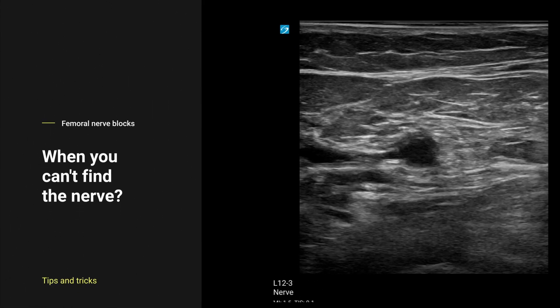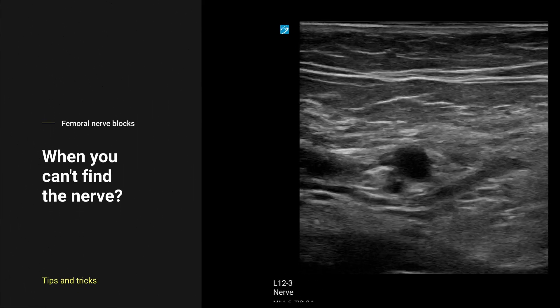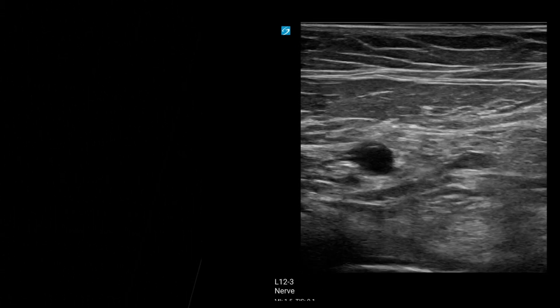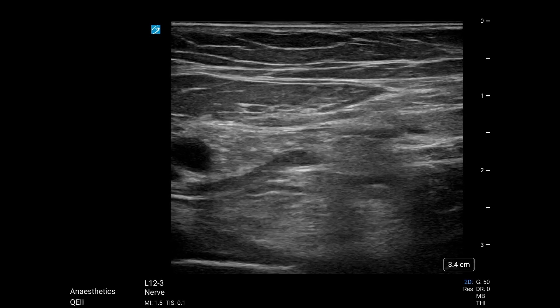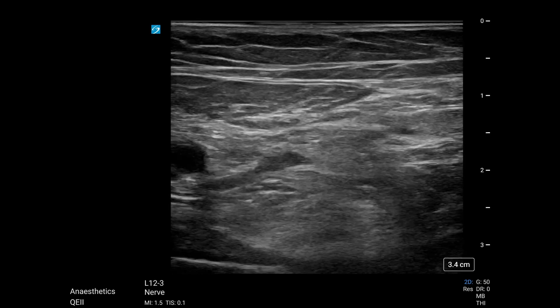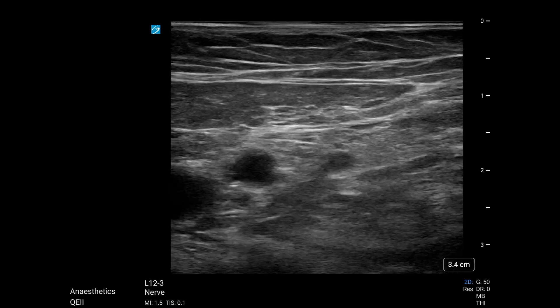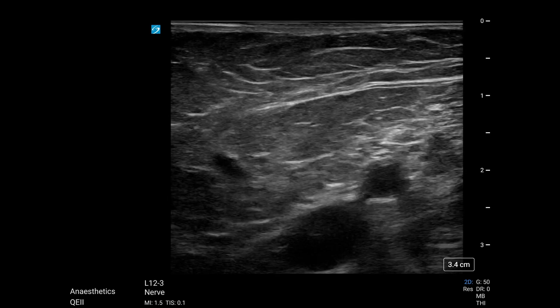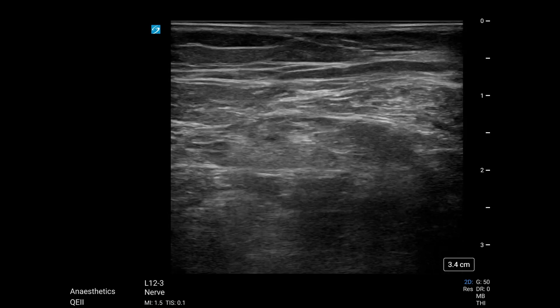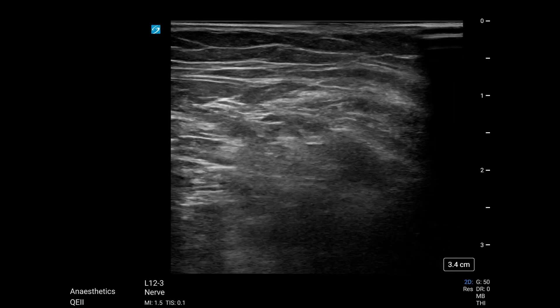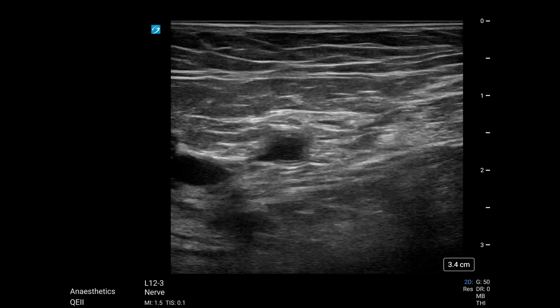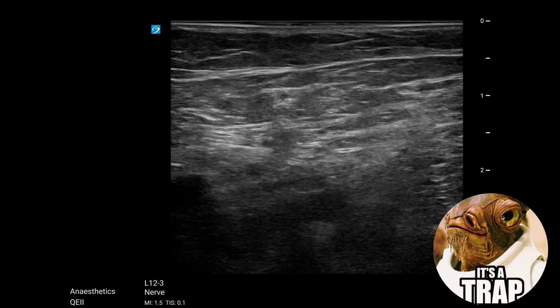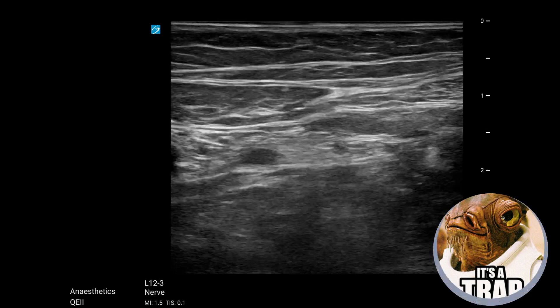What do you do when you can't see the femoral nerve, and how can we use the fascia iliaca to help us find it? In this video I'm going to show a near miss and some of the lessons that can be taken from it.